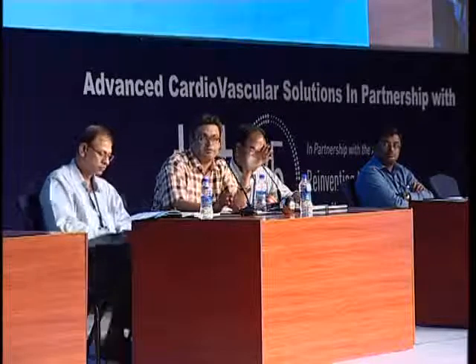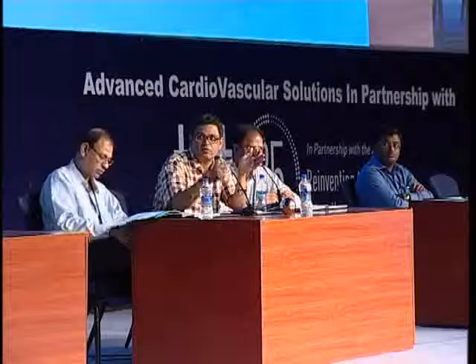Second thing is that, if you look at the stent migration or embolization series, older generation stent migrations were because of hand-crimped stents. That was the time when stent migration rates varied from 1% to even 8%. But after balloon-mounted stents became available, it has gone down to around 0.3%.